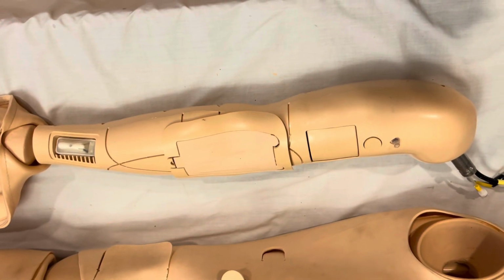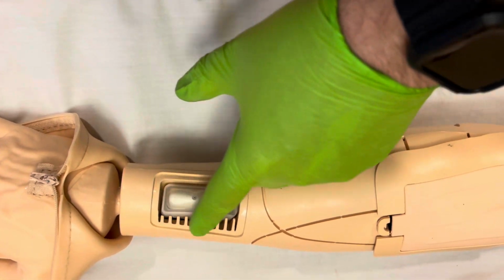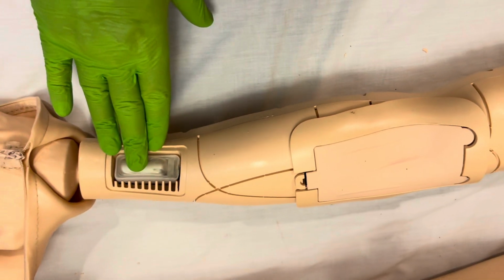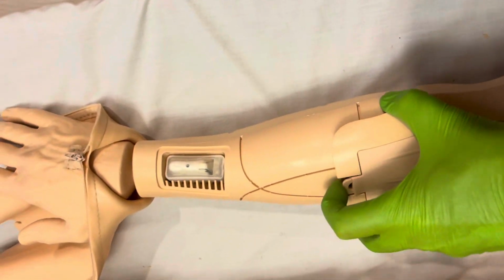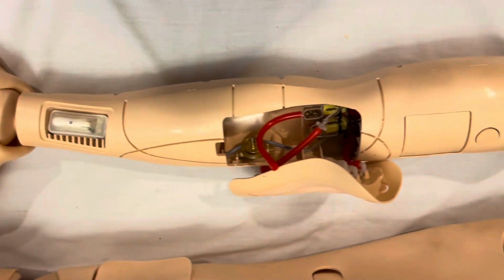All right, now that we've got all the screws put back in, by the way, if you have a piece of skin over the pulse area, just go ahead and peel it off and throw it in the garbage. You don't need it. It's just an extra layer for you to try to palpate the radial sensors or the distal pulses, and it just gets in the way. So next thing we want to do is roll the skin back over. So take this cap off and then slide the skin back over, which I can't do one-handed.